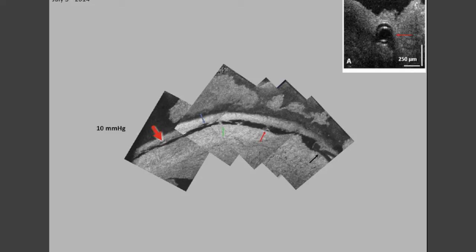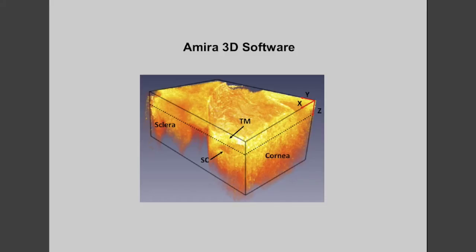We see collector channel entrances — multiple ones which are easily visible with the 3D technique. MIRA 3D software permits looking at the X, Y, and Z axis.